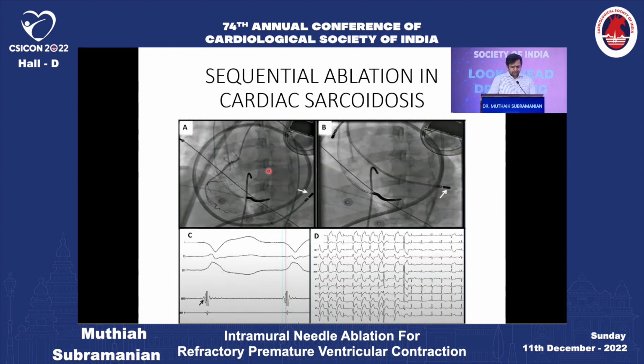So the concept of a unipolar or bipolar ablation is usually, if it's an endocardial substrate, you're going to approach it endocardially and find the appropriate site and ablate. And you can do this separately endocardially or separately epicardially. In some patients, you may be able to ablate the same site which you're seeing in figure A epicardially, then approach the same site similarly, independently, endocardially, and ablate them at two different points in time. And this can help in some patients with a mid-myocardial substrate.